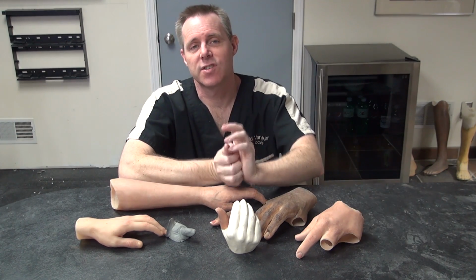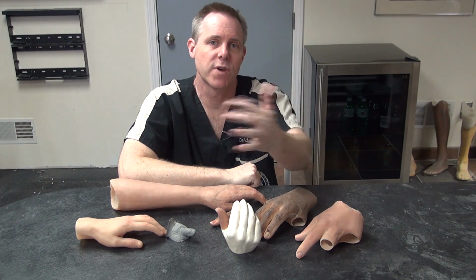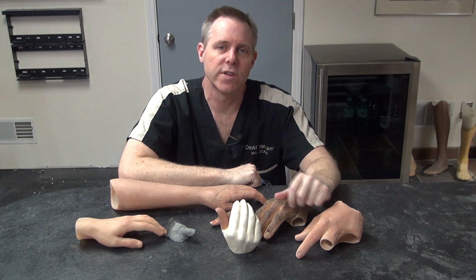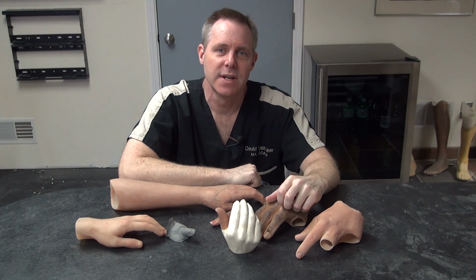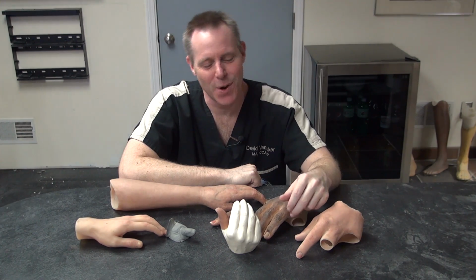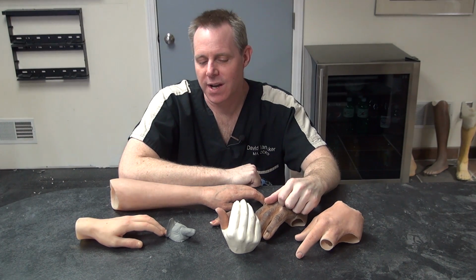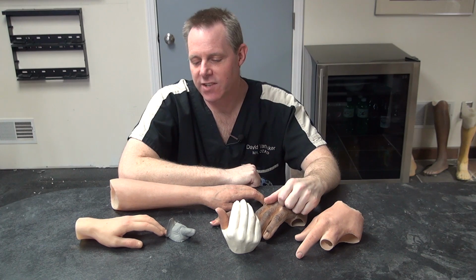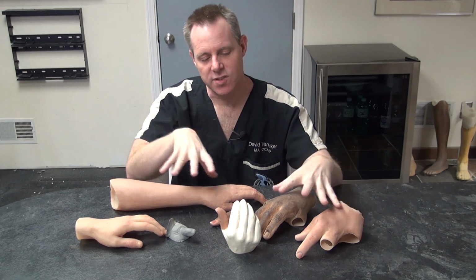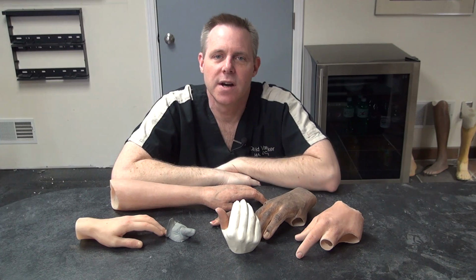He was missing just his thumb, but he wasn't able to get good counterforce to control the bow. So we created a way that he could hold his bow successfully and not have it pop loose and hit him in the head when he's trying to shoot his bow. So we got him back out and hunting again. So partial hands covers a wide variety of subjects. These are more cosmetic examples, but hopefully this gives you a good idea of what we can do.